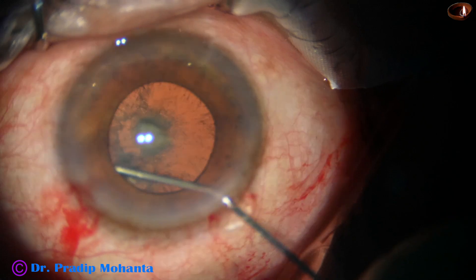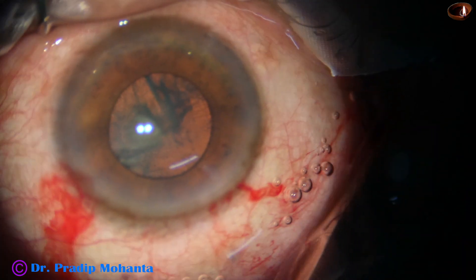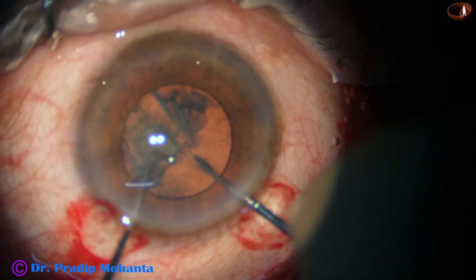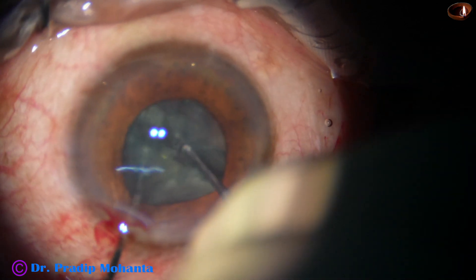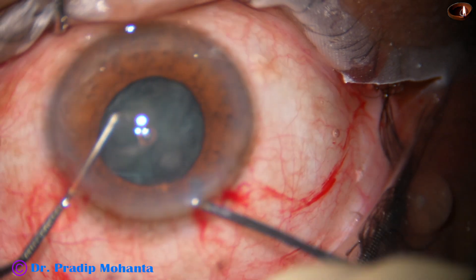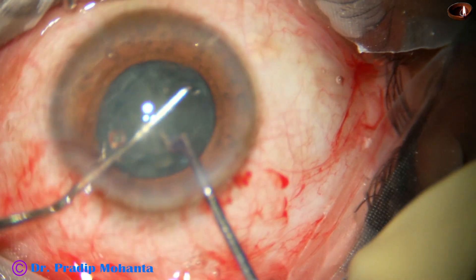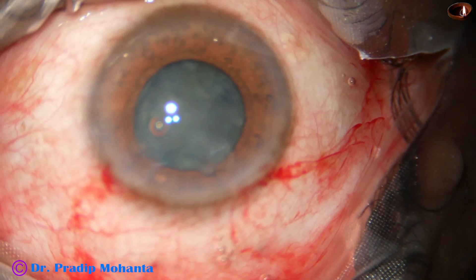Hydrodissection is done. Now the anterior chamber is filled up with 2% hydroxypropyl methylcellulose. I use the pre-chopper to divide the nucleus into pieces. This is the first cut. Rotate the nucleus, and then inject a bit of HPMC.